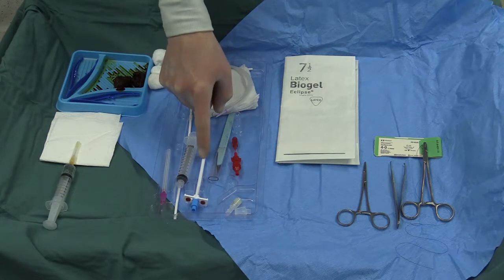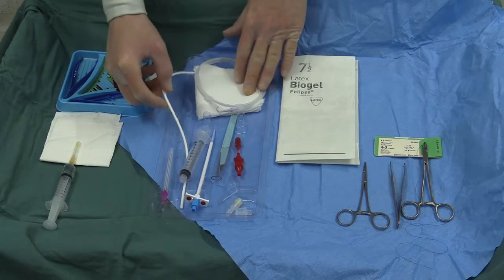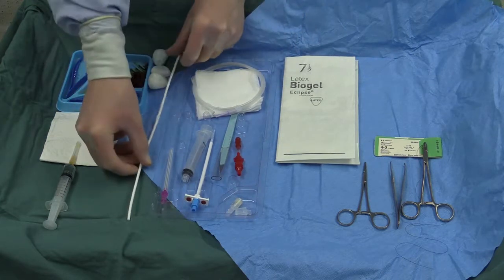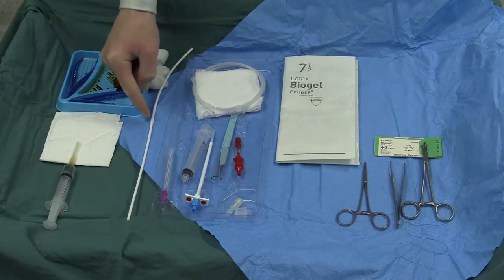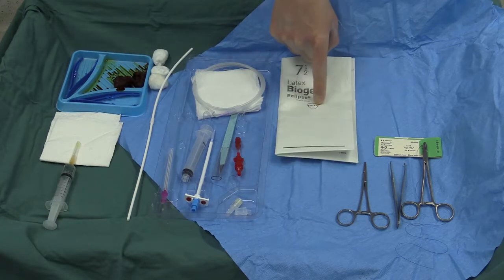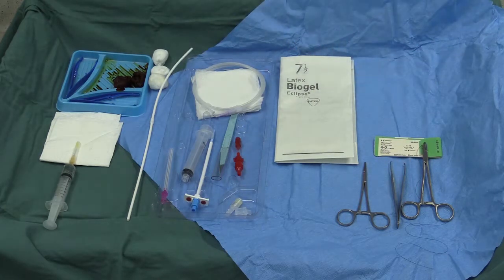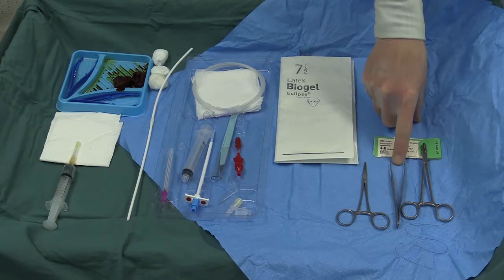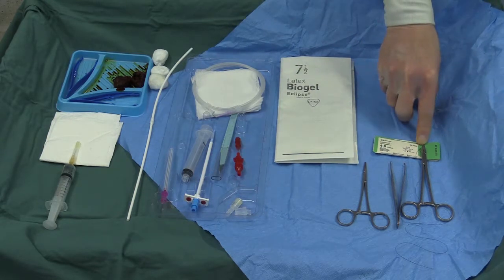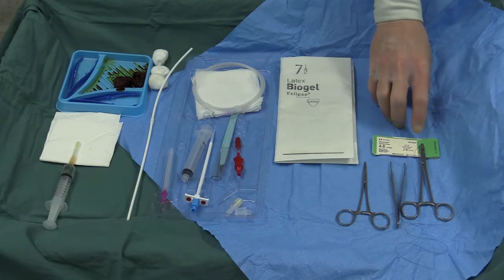and dilating trocar and the Tenckhoff catheter, which will be present in your packs with a single Teflon cuff. A pair of sterile gloves, essential, and some basic surgical instruments, including a mosquito forceps, toothed Adson, and suture material, non-absorbable monofilament.